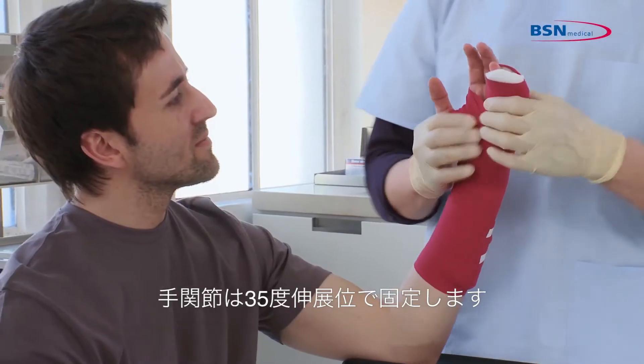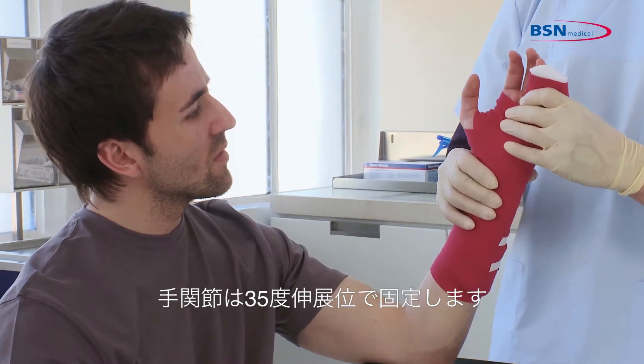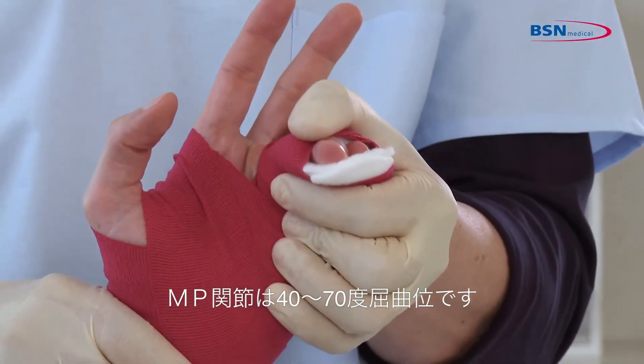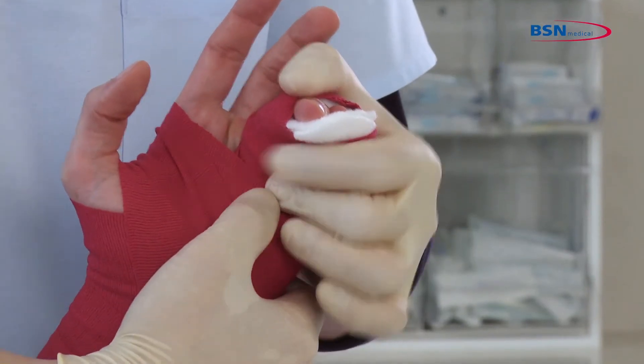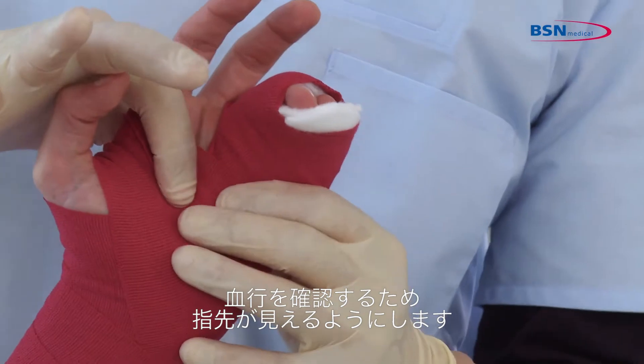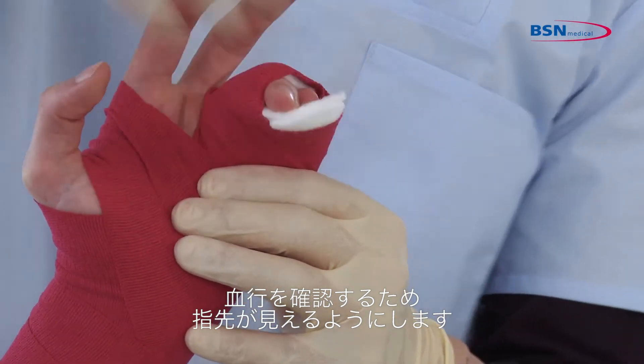Please be aware that the wrist should be at 35 degrees of extension and metacarpals at 40 to 70 degrees of flexion. Mould with your thumb inside the palm of the patient's hand and make sure to leave the fingertips exposed to check circulation.